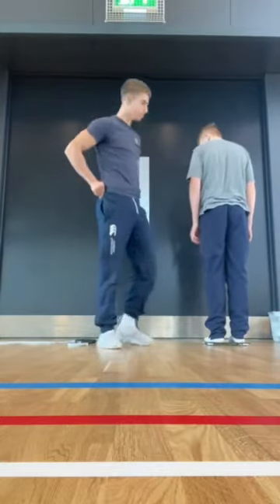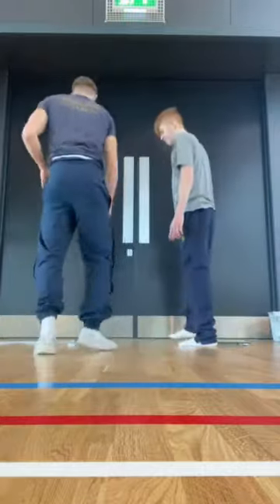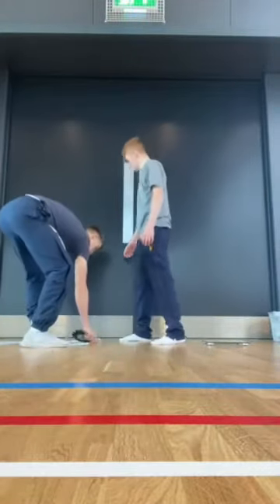74.6 kilograms. And then, where's your height? Can you set it up against this flat surface?